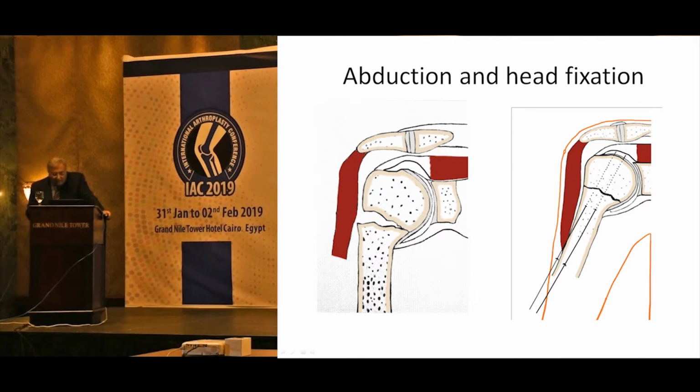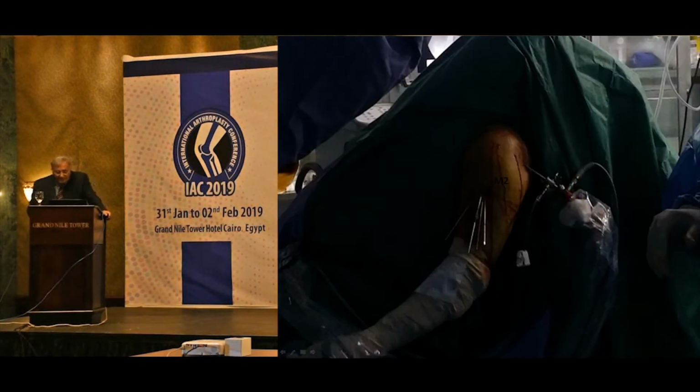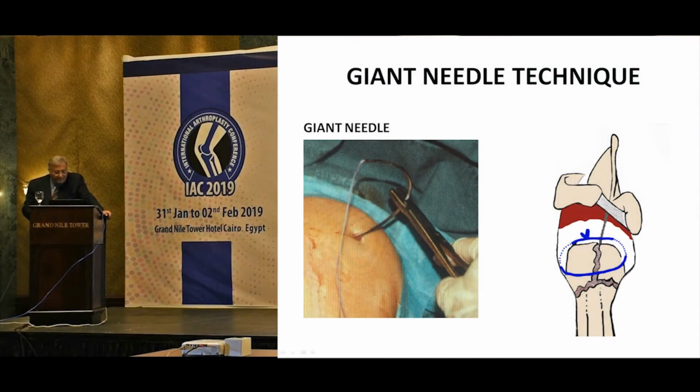And we go with the K-wire about 12 centimeters below the fracture, under imager and through the 2 fragments. It's like percutaneous fixation, and we can use here 2, 3, or even 4 wires to make this fixation. Of course, this is done also under arthroscopic and C-arm imager control. Now, after we fix the head to the shaft, we have a 2-part or 3-part fracture.